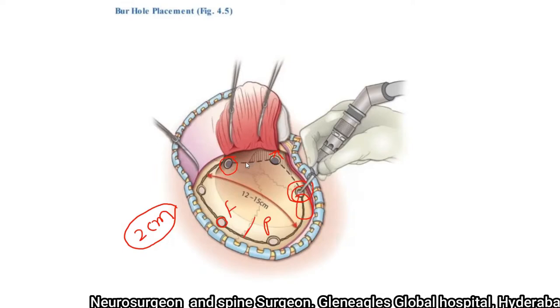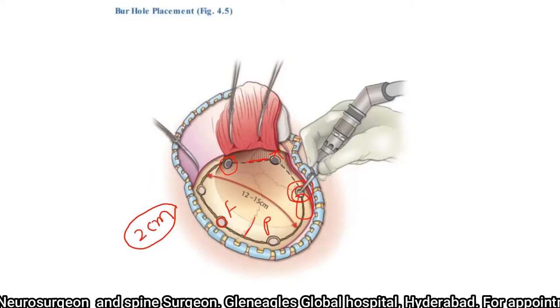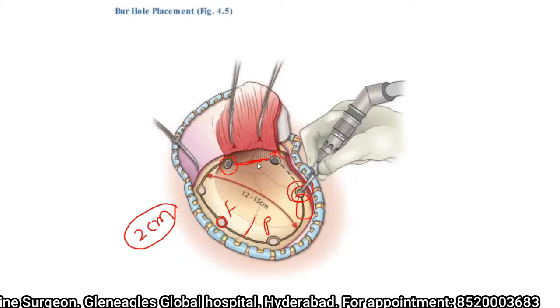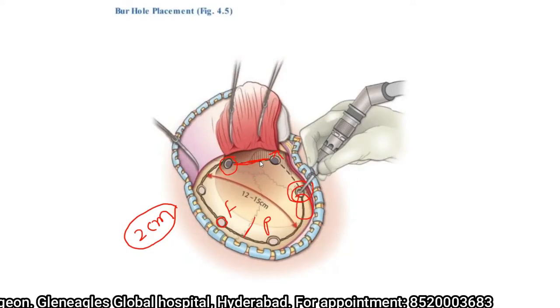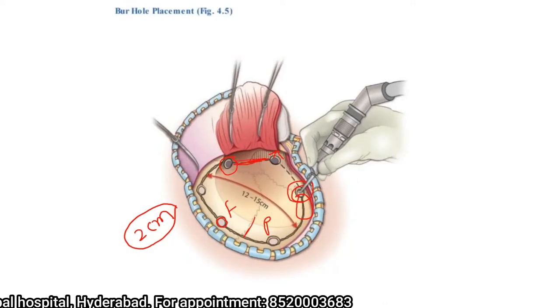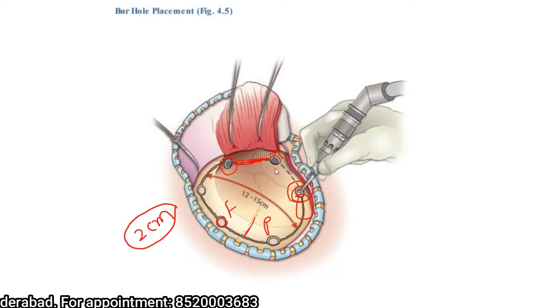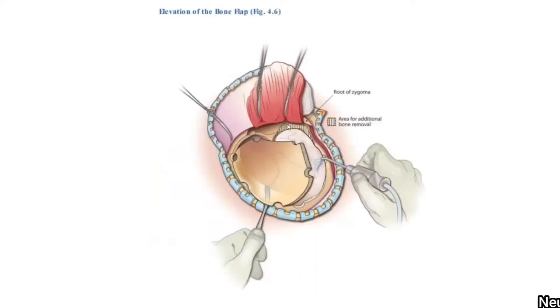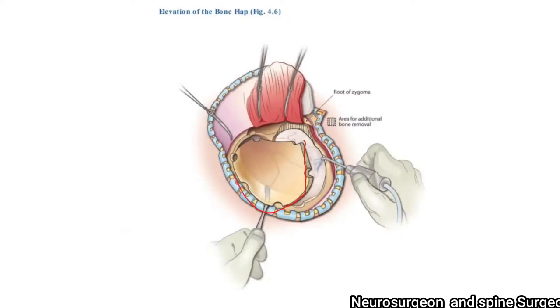At the sphenoid ridge, I drill the sphenoid ridge with a burr to make it papery thin. Then, once I have placed the burr holes, I use a craniotome to complete the cuts.